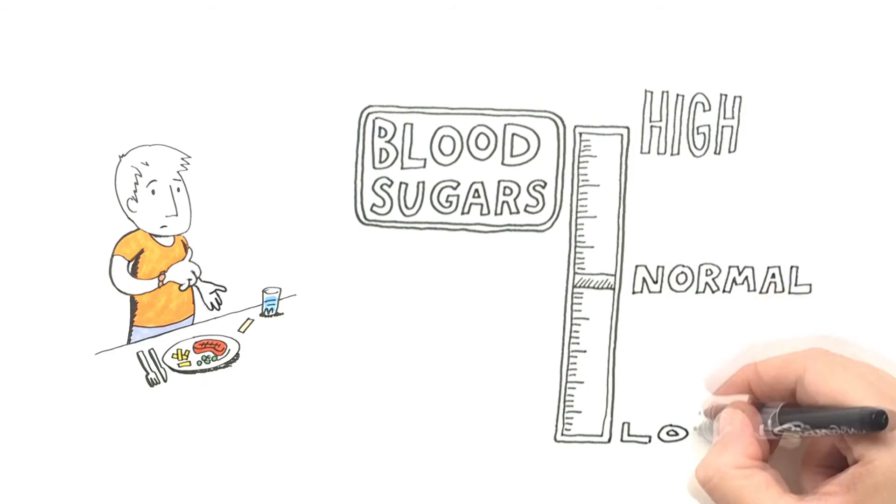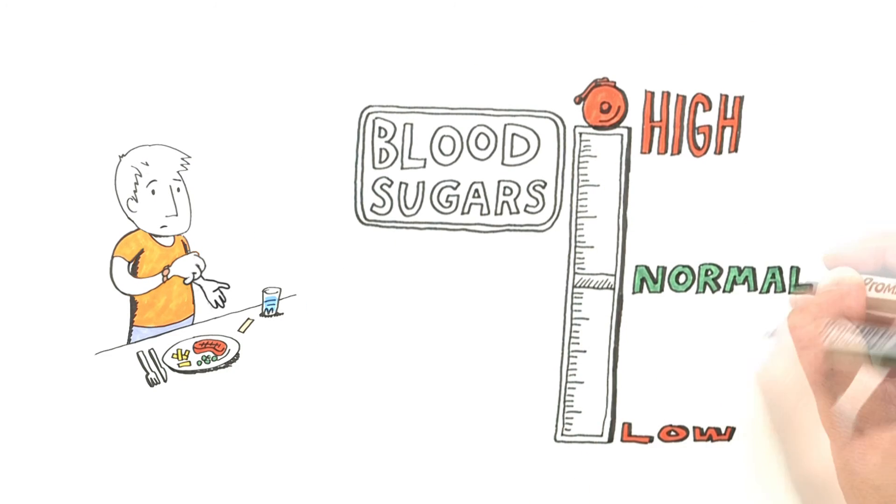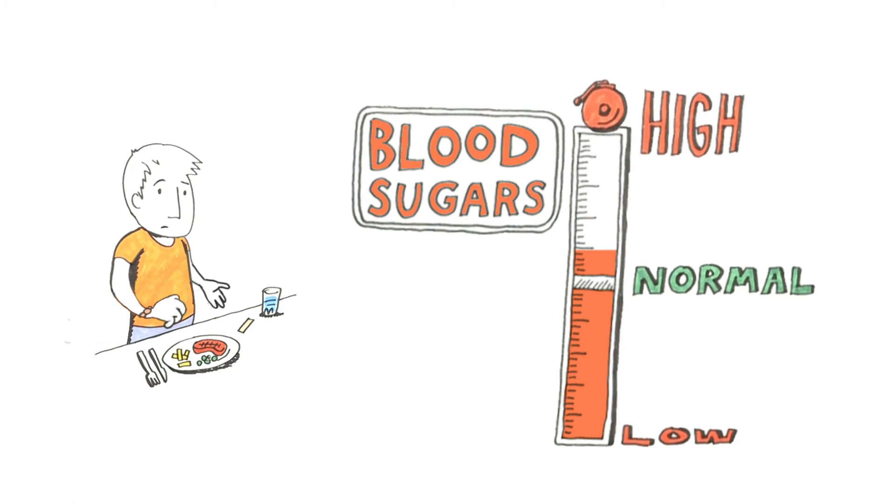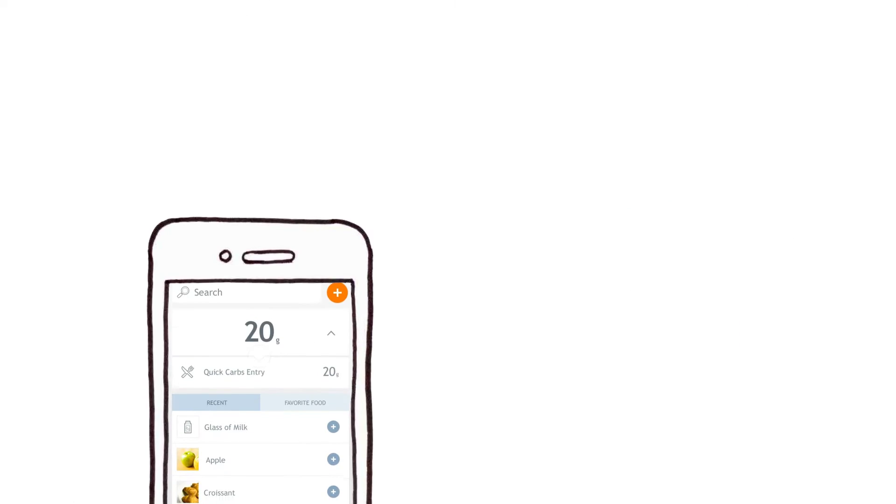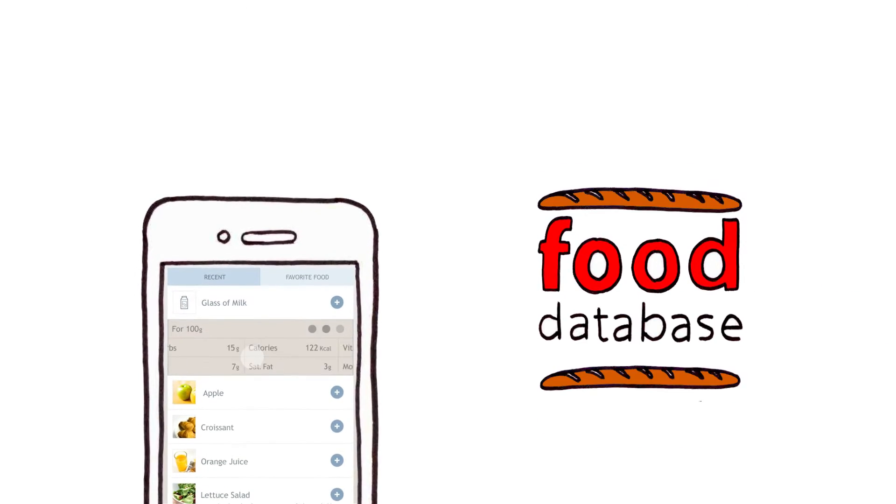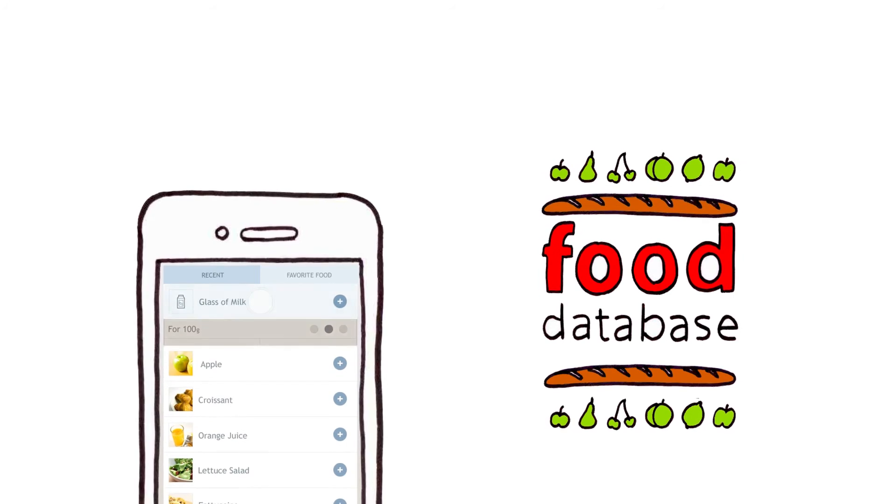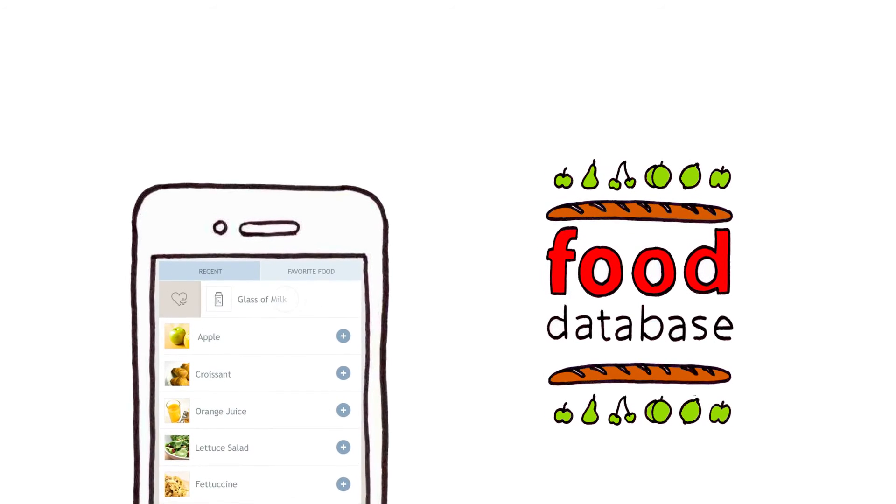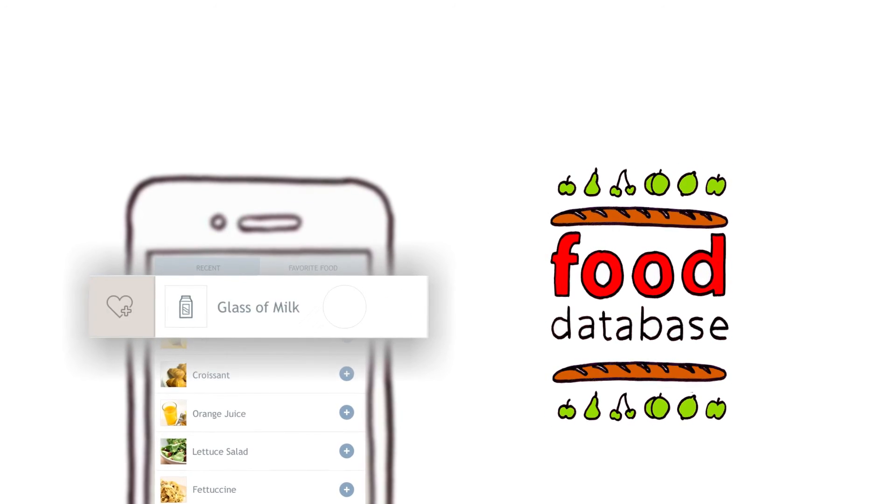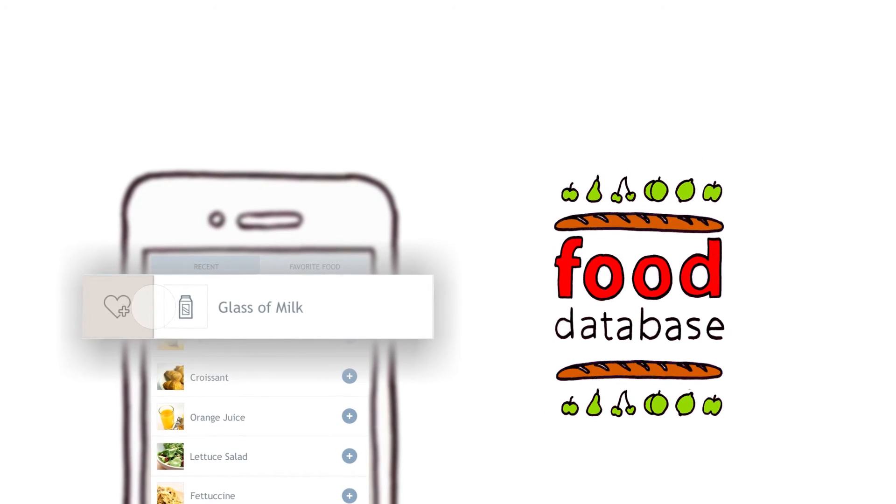Tracking your meals and learning how they impact your blood sugars is easy too. Daria includes a comprehensive database of foods. You can store your favorite meals so that they can be added in a tap.